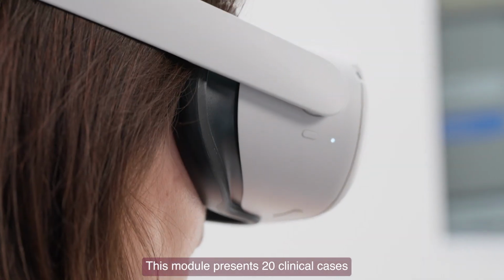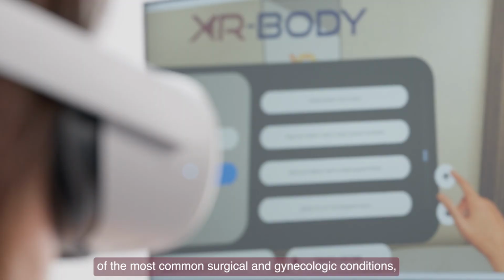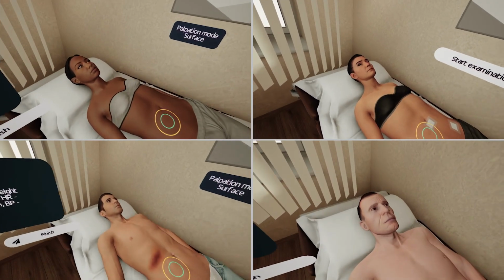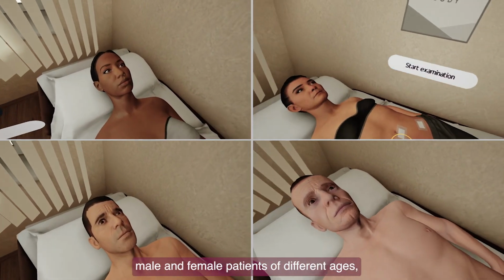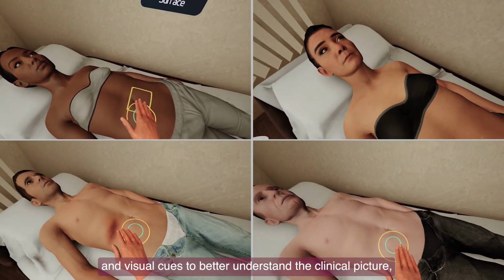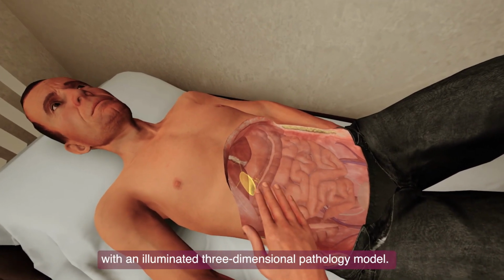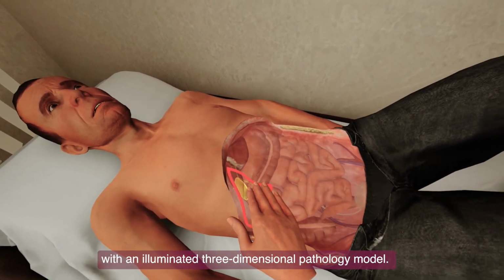This module presents 20 clinical cases of the most common surgical and gynecologic conditions. Male and female patients of different ages and visual cues to better understand the clinical picture, such as a transparent abdominal wall with an illuminated three-dimensional pathology model.